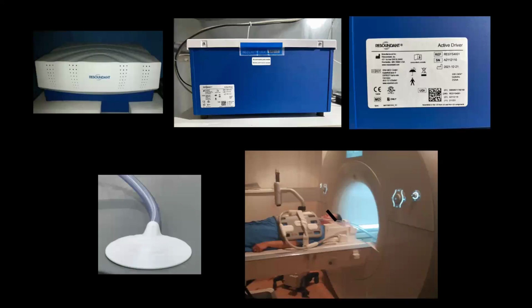This shows you, in the above two images on the left, the active drivers, and Resoundant is the only company at present, that I am aware of, which is coming out with the hardware for the MRE. And the bottom left is the passive driver, that oval shaped structure that is placed on the patient's abdomen.